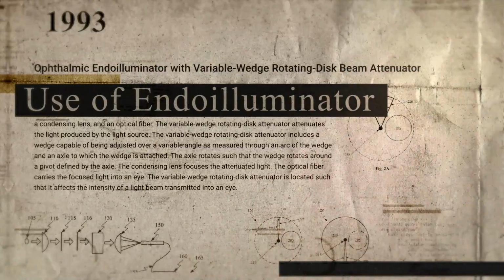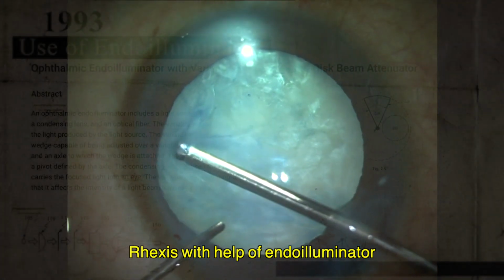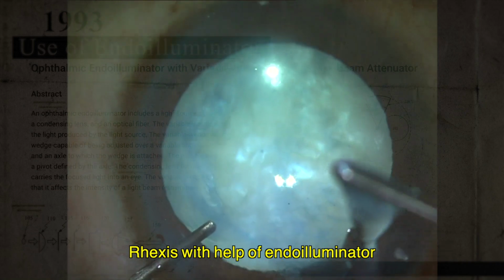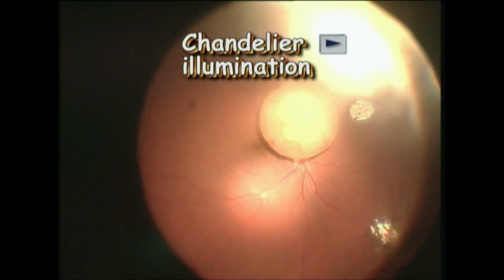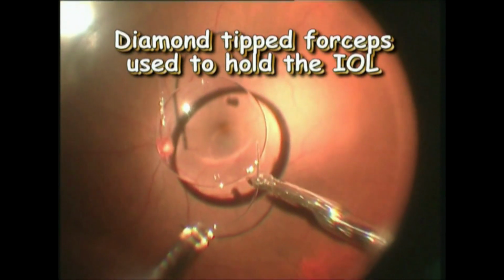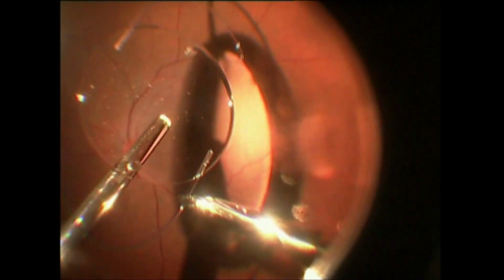Since 1993, use of ENDOILLUMINATOR has been described for cataract surgery for visualizing the anterior capsular flap in hypermature cataracts, ENDOILLUMINATION guided irrigation and aspiration during combined 23-gauge sutureless vitrectomy, as well as ENDOILLUMINATED infusion cannula for bimanual anterior chamber vitrectomy has also been described.